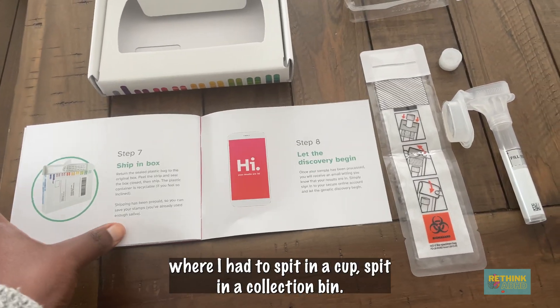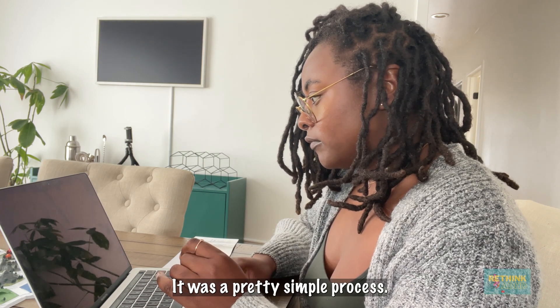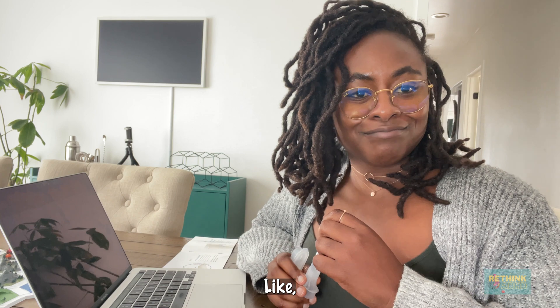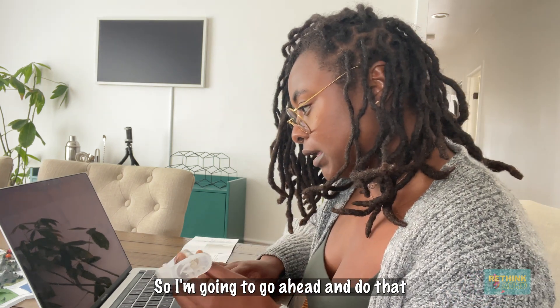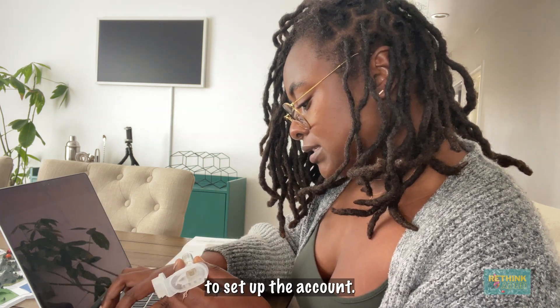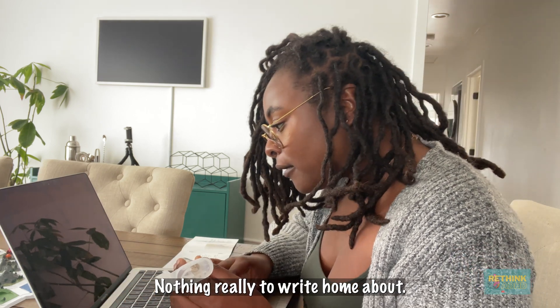This is my first time doing one where I had to spit in a collection thing. So the first step, once I opened the box, was to set up my account and register my kit. It was a pretty simple process. I'll walk y'all through the screens I'm seeing, in case that's helpful. That took maybe like two minutes to do. After you do that, it looks like it asks you to put in this little barcode here. To set up the account, it was really straightforward — they just asked for your name, basic stuff to set up any online account. Nothing really to write home about for that.